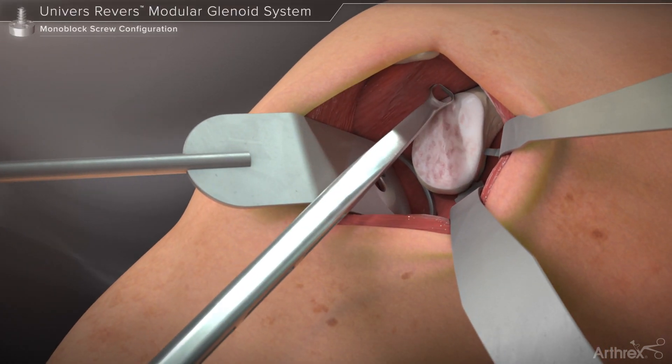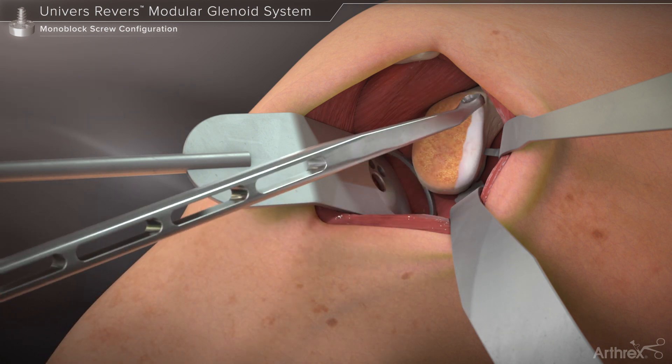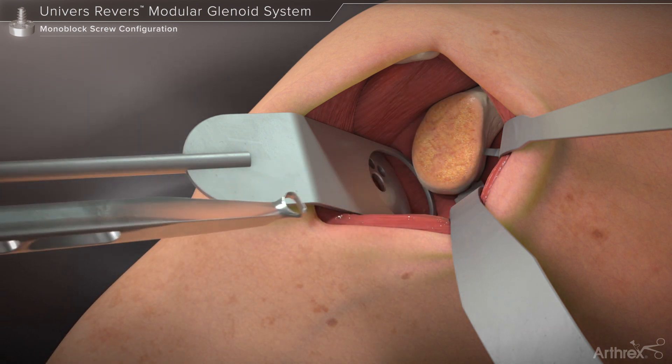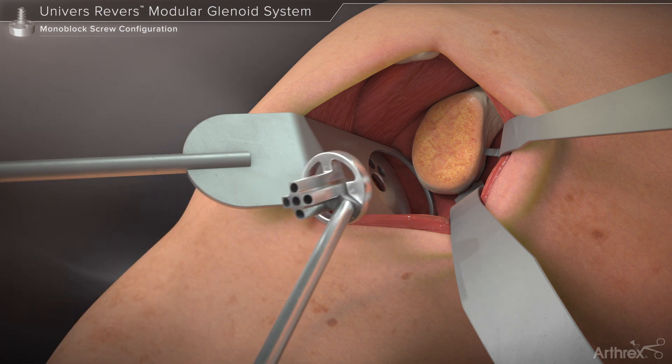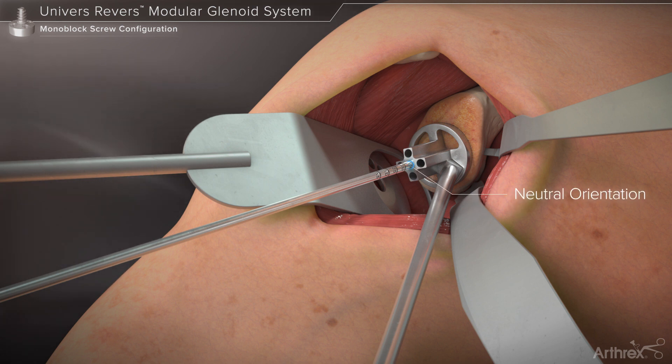The cartilage is removed from the glenoid face using the glenoid scrapette. The glenoid pin guide corresponding to the desired 24 or 28 millimeter diameter base plate is placed on the glenoid face and the calibrated 2.8 millimeter guide pin is driven into the glenoid. The central hole within the guide provides a neutral orientation while each of the four peripheral holes orient the pin 10 degrees divergent from the neutral pin axis.